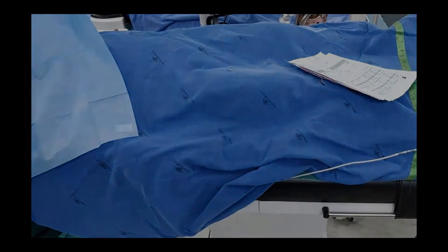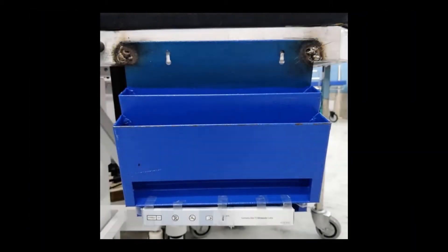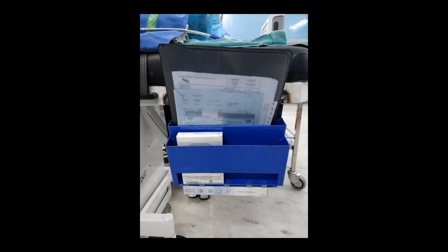Clutter-Free OT Table. OT tables often get messy by patient's case sheets lying on them. A clutter-free OT table can be achieved by fixing a simple side tray to it for keeping the case sheets and IOL.